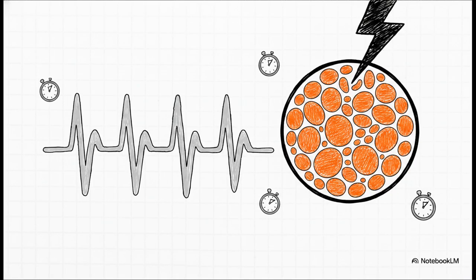Now, as an anesthesia provider, you absolutely have to know what your equipment is doing behind the scenes. The Train of 4 delivers a frequency of 2 Hz, meaning 2 stimuli per second. With an interval of 0.5 seconds between each stimulus, the entire burst is over in exactly 2 seconds. Quick and dirty. But notice that last point. The current is supramaximal, usually sitting between 30 and 60 milliamps. Why so high, right? Well, because we have to make absolutely sure that every single nerve fiber within that bundle is depolarized, so we get a truly accurate read of the muscle's potential.